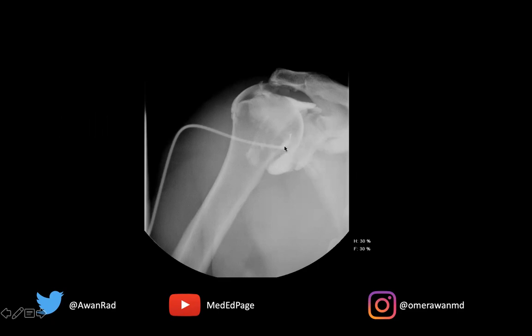The subscapularis is coming here and inserting onto the lesser tuberosity. The supraspinatus tendon is usually right here. The space between the subscapularis and the supraspinatus is known as the rotator interval, and that's often a place where you can gain easy access into the glenohumeral joint.